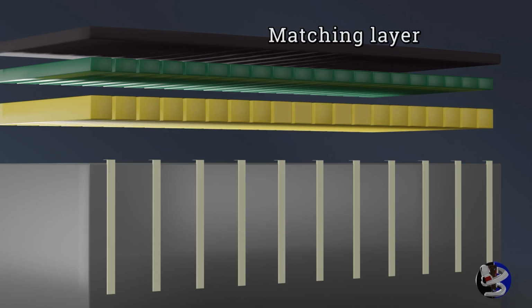The matching layer reduces the acoustic impedance so that ultrasound waves can penetrate body tissue and allows the returning echoes to be returned to the crystal for the same reason. Think of acoustic impedance as the resistance to flow of sound waves through tissues. This is the reason you always want to use gel in front of a probe so that acoustic impedance lowers enough to let the waves in and out of tissue.